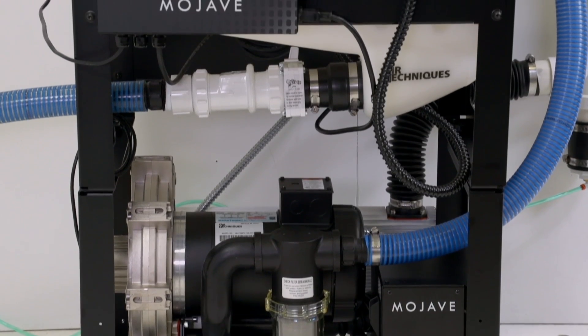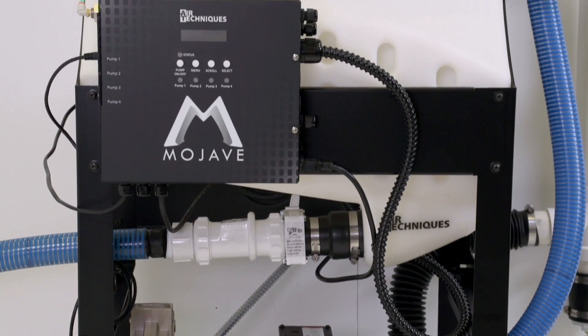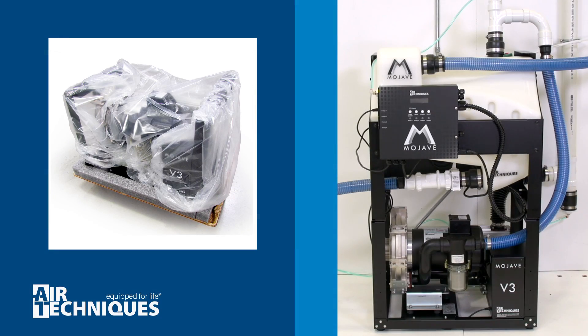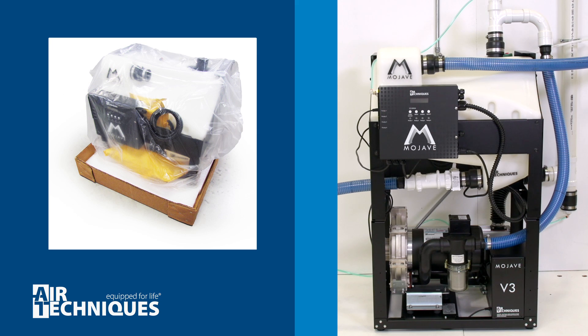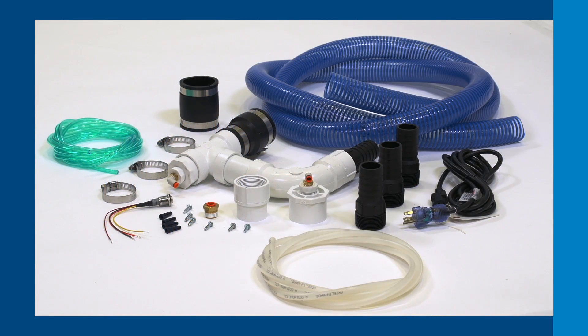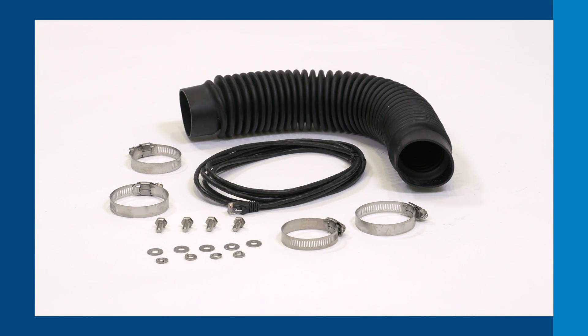For this tutorial, we will be reviewing how to install the Mojave dry vacuum system in an office setting. Remove the pump assembly from its packaging, then remove the tank assembly from its packaging. While unboxing, inspect both assemblies for shipping damage. Lay out the accessory kit near the associated assembly. These accessory kits can be found within the packaging.